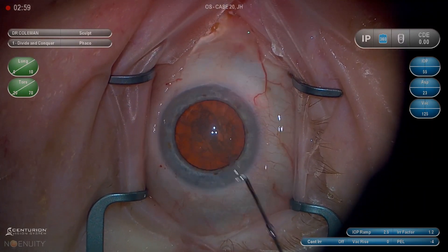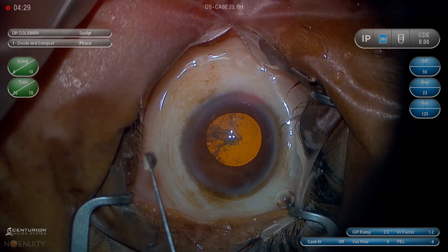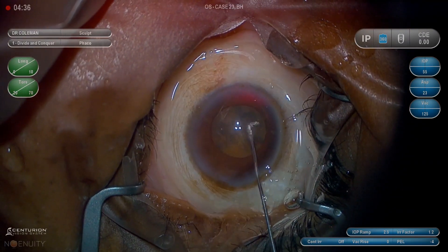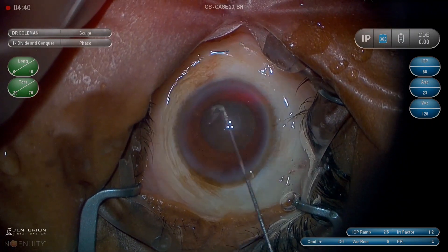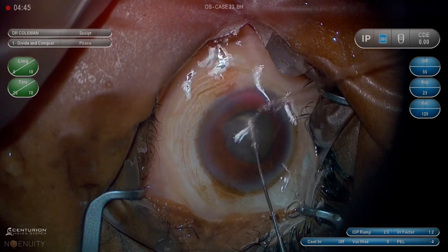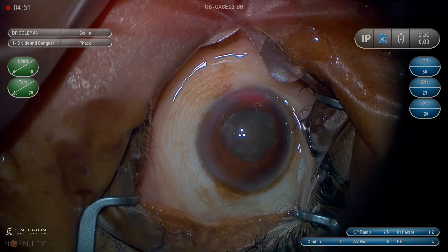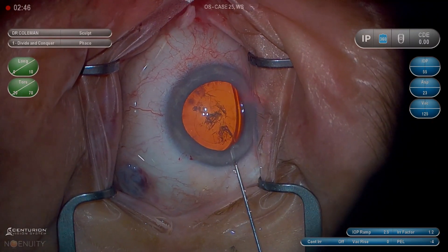I'll also try to do a video later on blooping the lens. I always say I've blooped it and regretted it a lot more times than I've gone to divide and conquer and wished I would have blooped it. So if somebody's not really young with a very soft lens, I'm probably going to avoid a bloop and go straight to divide and conquer — because you can always switch from divide and conquer to a bloop, but it's really hard to go the other way once the lens is out of the bag. A lot of times you'll get a pretty dense lens in the anterior chamber, which is real tough to handle. So in most cases I'm going to go straight to divide and conquer, even if it's a little soft, because I'd rather err on the side of caution.